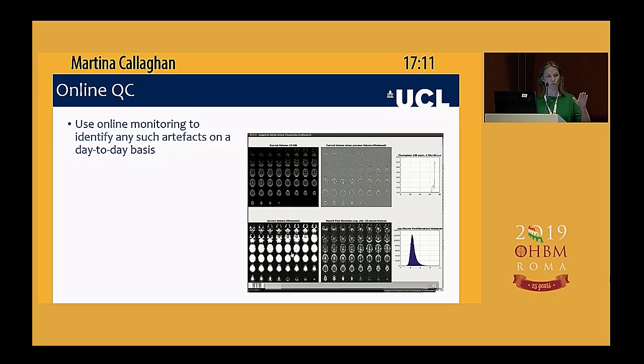Here it is again, but windowed down so we can look in the noise and see if there's any artifacts present, if there's anything in the background. Here you see the difference from one volume to another. And down here you see something over a larger temporal window, where we're basically downweighting volumes from the past, so it has a difference over a longer time scale. And then we can look at a summary measure of the signal amplitude and a histogram.